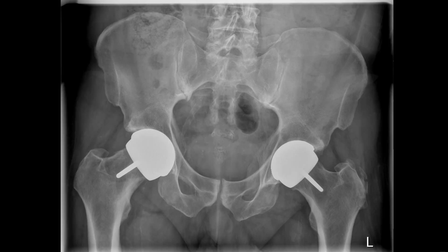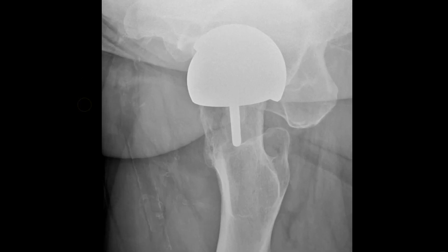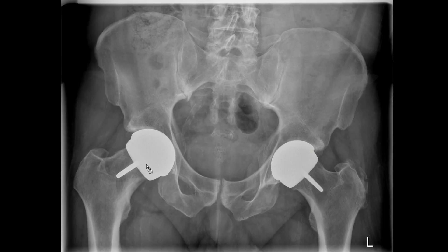This is a different patient who has bilateral ASR, which stands for articular surface replacement — also a metal-on-metal system, as you can appreciate with the metal cup and the large femoral head. On the axial view on the right hand side you can see there is osteolysis, which is less visible on the AP view, so let's have a look at the MRI.